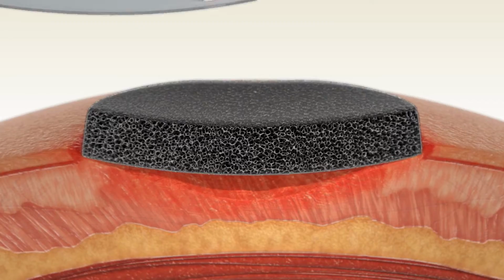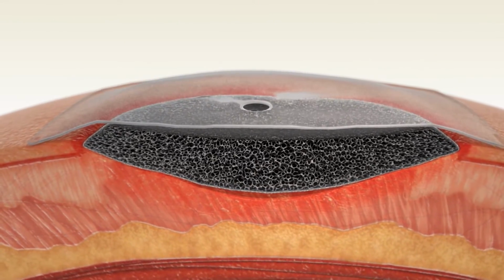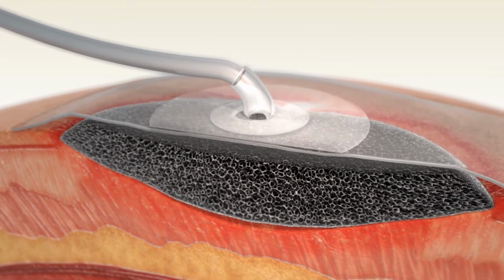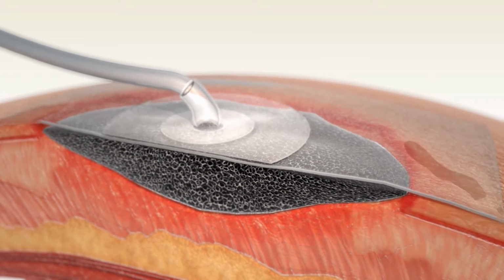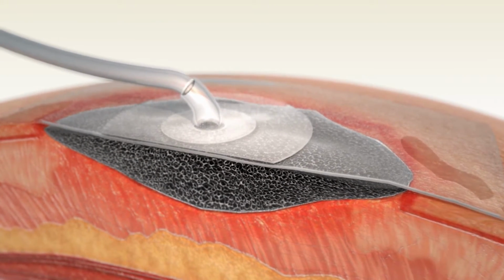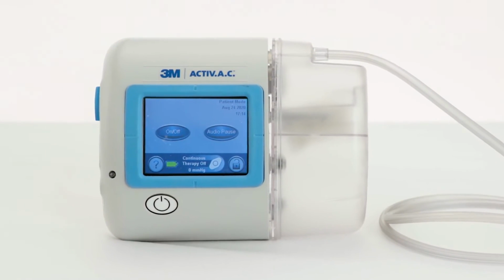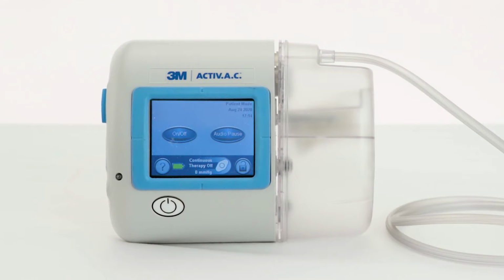for treatment. The VAC dressing goes on or inside a wound. The wound area is sealed with the clear VAC drape with adhesive that helps maintain negative pressure over the wound. One end of the tubing connects to the dressing. The other end connects to the canister that fits into the therapy unit.